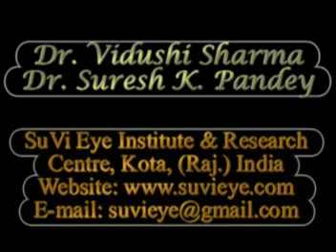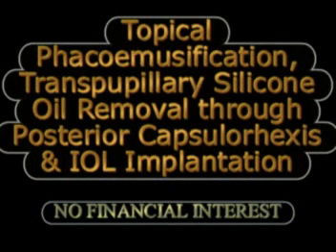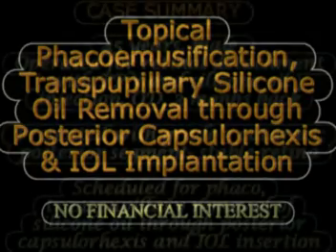Hi, I am Dr. Vidushi from Suvi Eye Hospital, Kota, Rajasthan, and in this video we describe the technique of transpupillary removal of silicone oil with phacoemulsification in eyes that have undergone pars plana vitrectomy with silicone oil injection for a complicated retinal detachment.